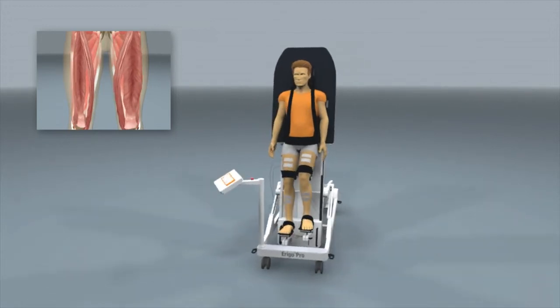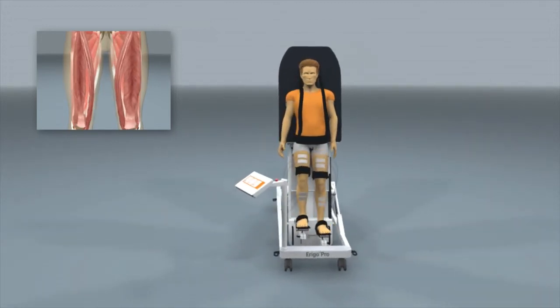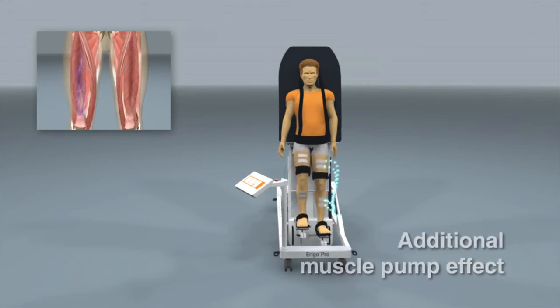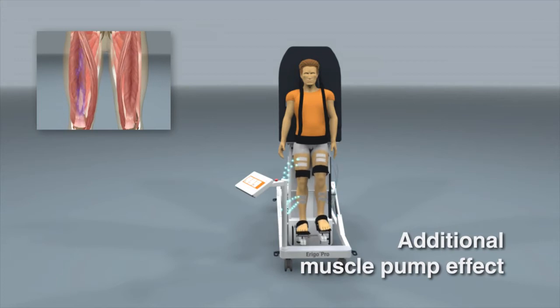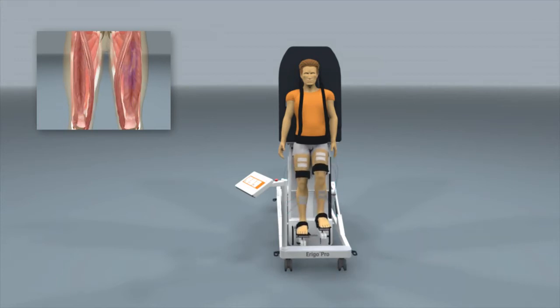The Erigo functional electrical stimulation supports the contraction of the lower limb muscles and increases the muscle pump effect. The stimulation is fully synchronized with the robotic leg movements and offers up to eight adjustable channels.